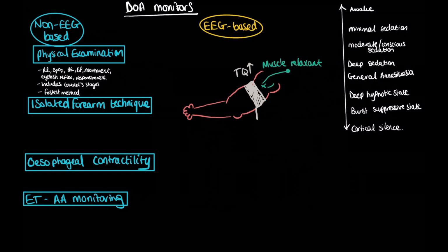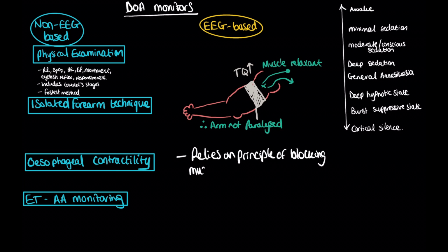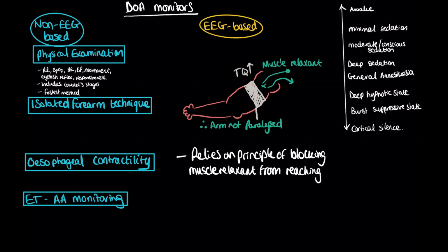So, if the subject is aware enough, they will be able to respond to commands and move the hand in order to signal awareness. This is considered the gold standard method of monitoring for awareness, but it's not widely used in day-to-day anaesthesia. In fact, the NAP5 study, which examined accidental awareness under general anaesthesia, showed that only 0.03% of anaesthetics given in the UK used IFT.